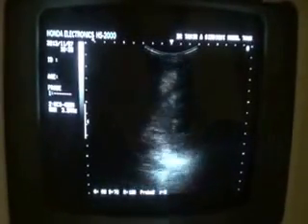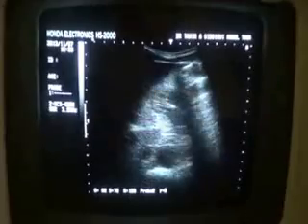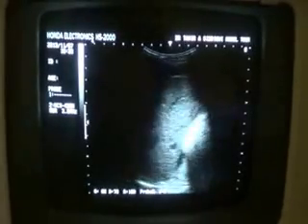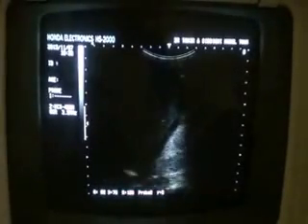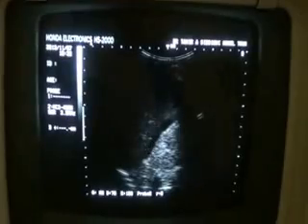A complicated case that started from cardiomyopathy has advanced to bilateral renal parenchymal changes of grade 2. You see that the echogenicity of the renal parenchyma of the right kidney is much more raised than that of the normal liver.